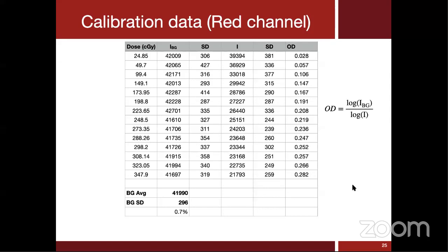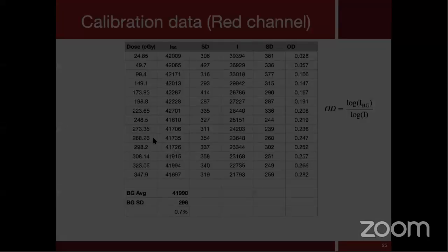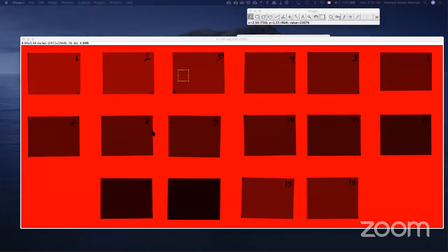The films should not be too small, also, because of the cutting. This is also like here, for example. I would not take any signal very close to the edge of the film. I try to take the region of interest inside. So if your films are becoming smaller and smaller, then you will have a limit on the size of this region of interest.